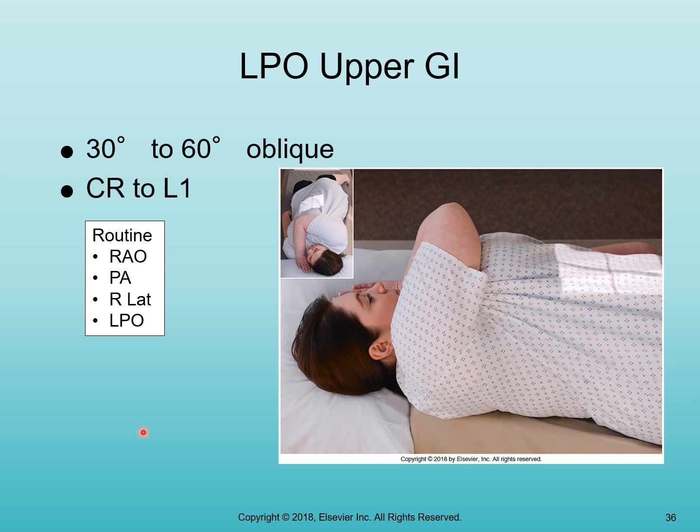So worst case scenario during a fluoro procedure, if you have no clue what to use, 110 at 2 if they're not in a lateral, 110 at 4 if they are in a lateral, pretty much would work on all sthenic patients. We do use left marker, and we place that left marker down.